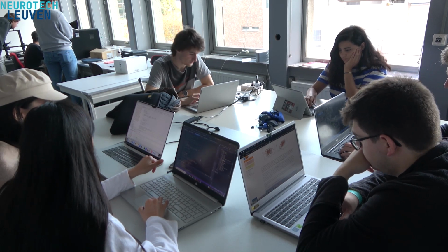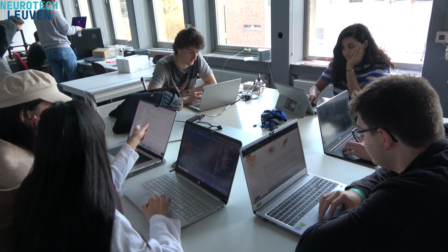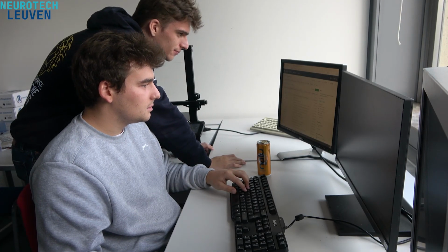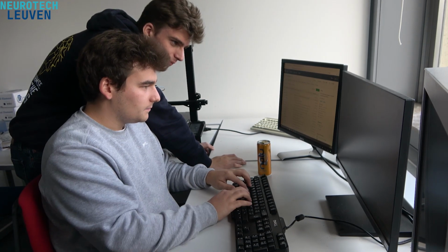Indeed, during the project we have faced many challenges, of which some have been solved and some unsolved. Firstly, the stimuli had to be consistent, and doing this in a browser is difficult. We experimented with many parameters such as color, size, distance, and shape to get the best results, along with adjusting built-in browser parameters. But there is room for improvement.